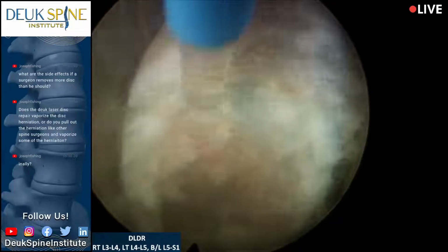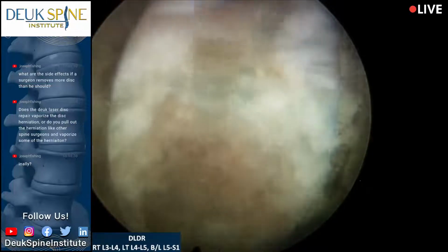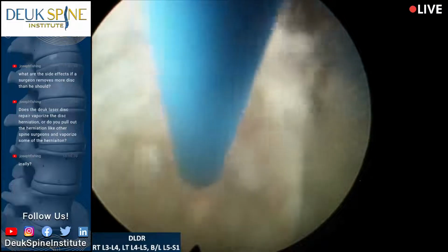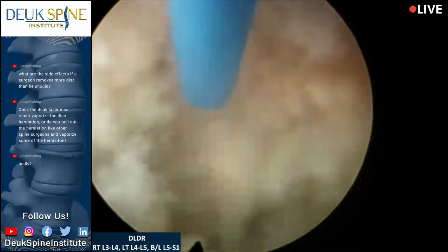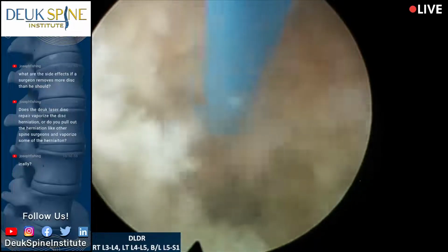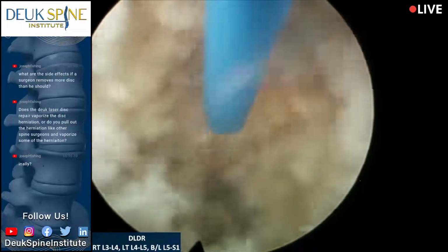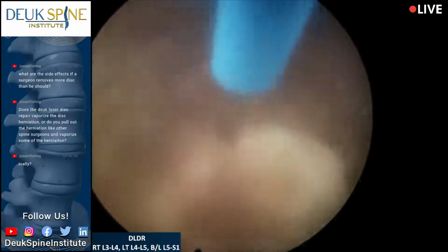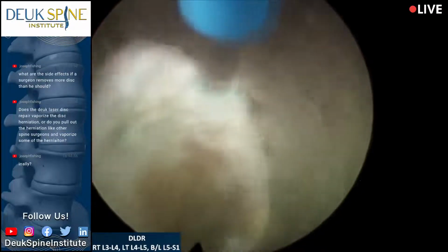But the first answer I gave, that you could take the whole disc if you wanted to and the patients don't have any symptoms, that's true. But we're not taking the disc out here. We're just removing the herniation. So the herniation starts right here where you're seeing the tip of this glass laser fiber, right there. That's where the herniation starts. And it travels all along here and ruptures to the outside. Yeah, that's fine. Thank you. So, anyway.